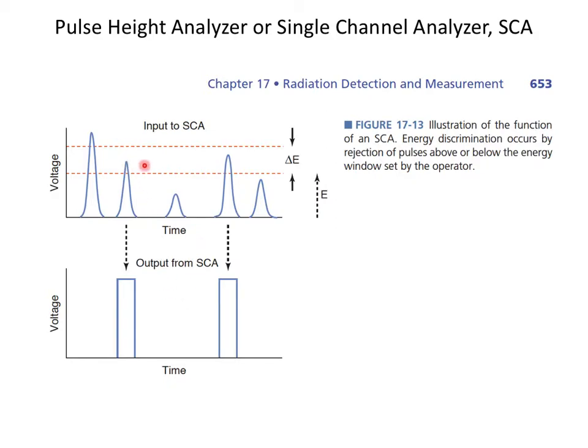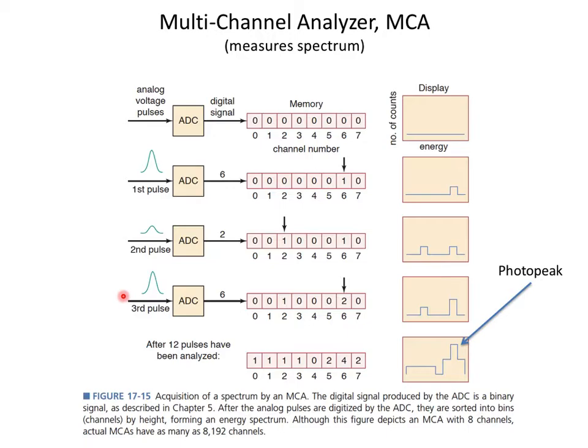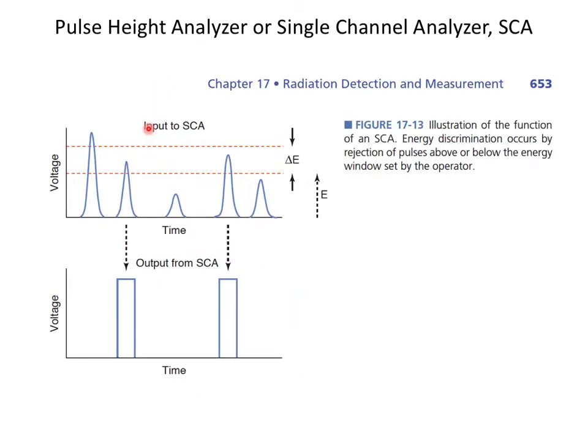And so you change this continuous voltage pulse into essentially a discrete, digital signal, of when you have actually seen a positive event from your scanner. So what is done with those pulses is, we'll take a step back, where we've got these pulses coming in here.